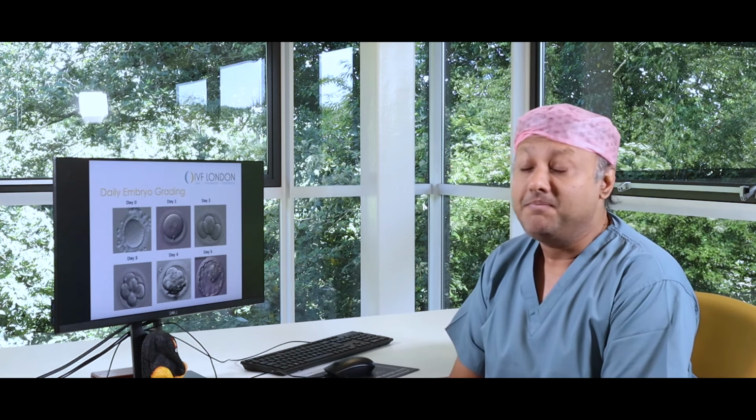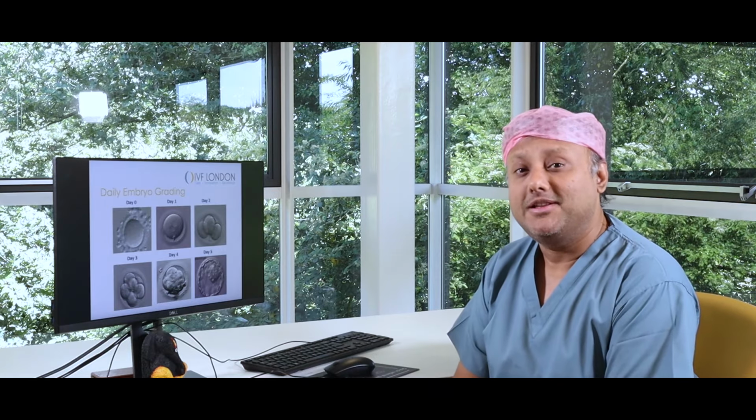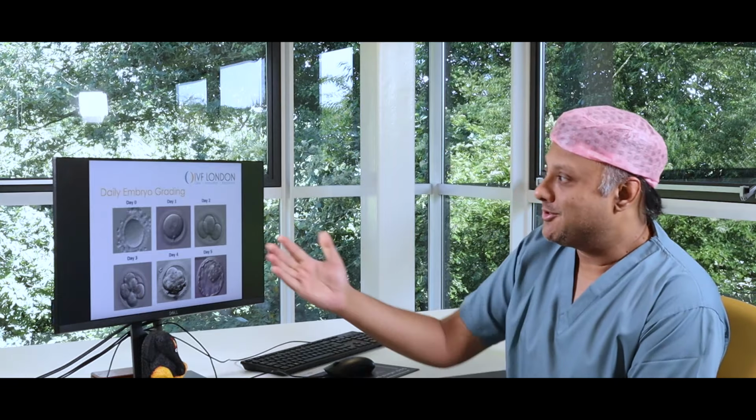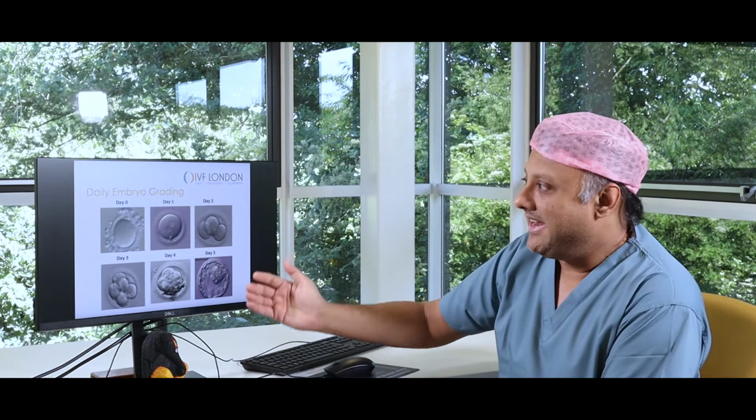Today's seminar is going to be educating our patients on embryo scoring and what embryologists do in the laboratory to look at the development of your embryos. So we'll show you some of these stages on the screen here.